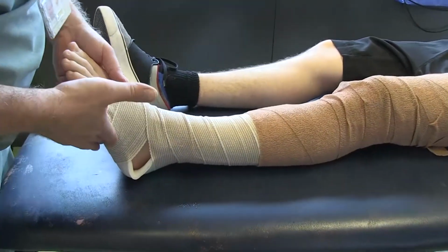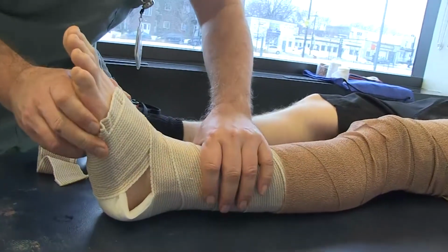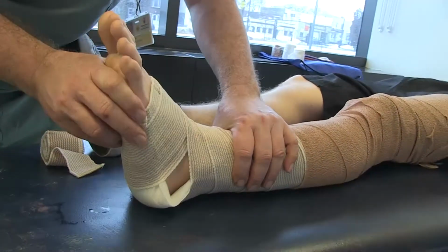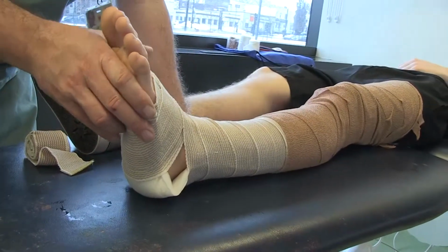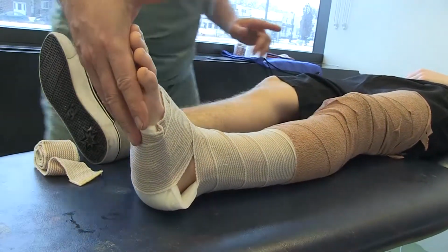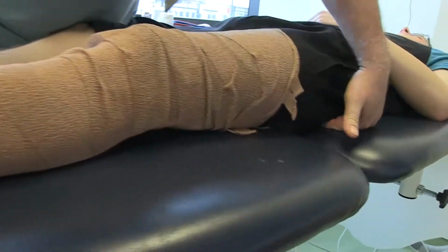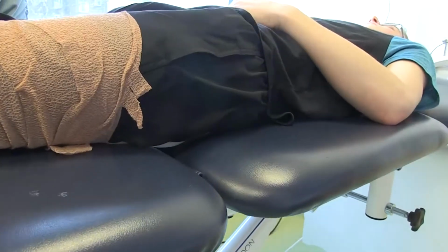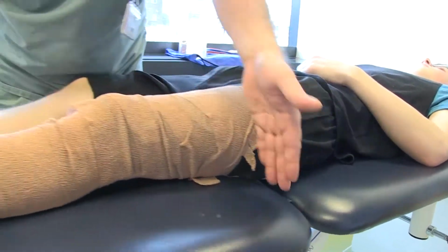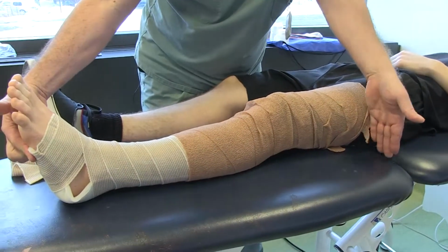Now what I was about to explain is, the reason we hold the foot is that we want to prevent it to fall towards one side or the other, which could cause a torsion in the femur. That's really important. The other thing is, the fact we bandage up to underneath the buttock will prevent this rotation as well. If we had stopped the brace before the buttock, we do not prevent this rotation.